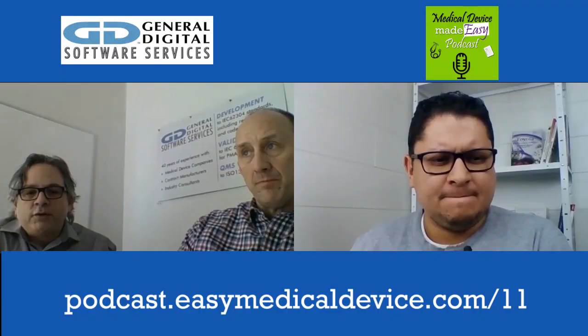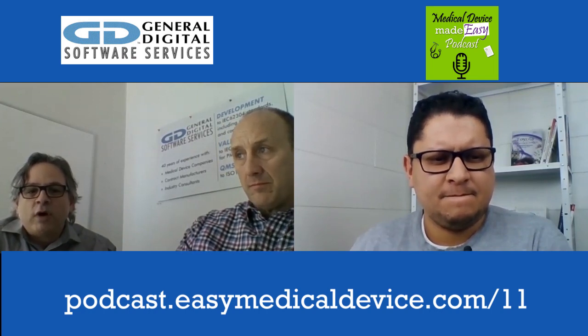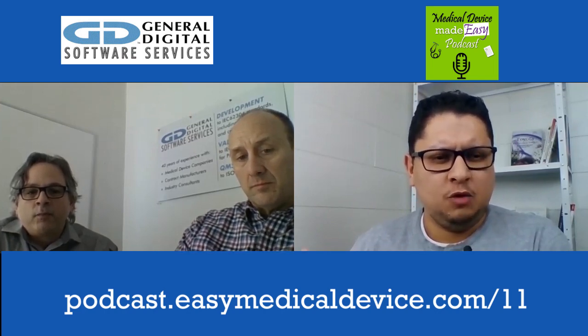But at the end, do you think we should validate those tools only once, or for each new project or each new product do we have to revalidate them? The true answer is that you really should, especially if the tool is being used in a different environment; you should rerun those cases in the new environment to make sure that it still works. So it's the same as what you said. Risk is really the word that we should use here. As soon as the risk changes or there is a higher risk, then we should rethink all this validation and see if it's still applicable.